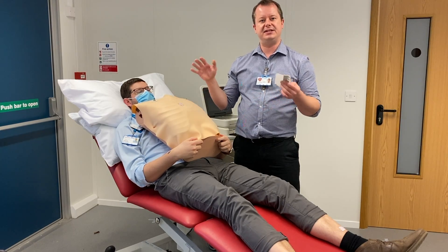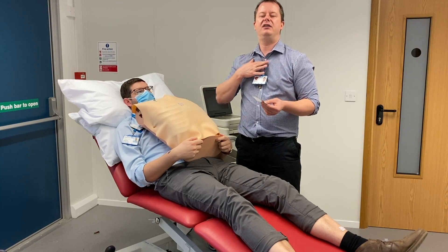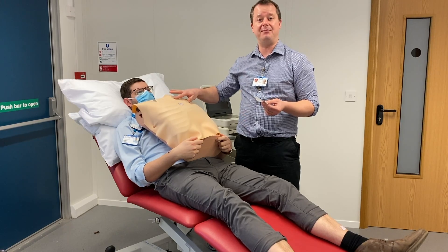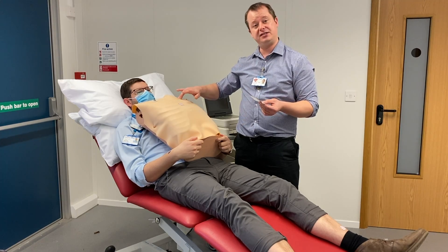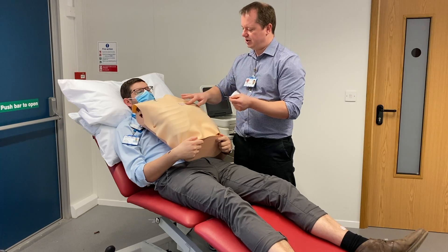A lot of times people make mistakes and can't find the intercostal spaces very easily. A useful trick is to find your angle of Louis, which is a little bump on your sternum where the two bones join together. That is always opposite the second rib. So if we find the angle of Louis and feel across, we can find the second rib. Above that is the first intercostal space, below it is the second, third, and then fourth.